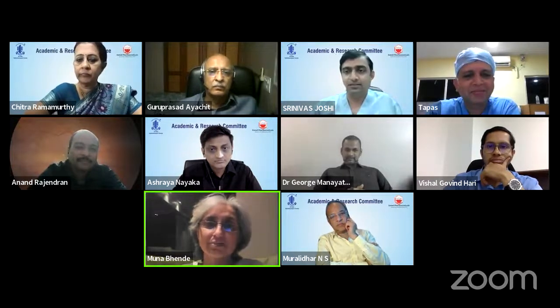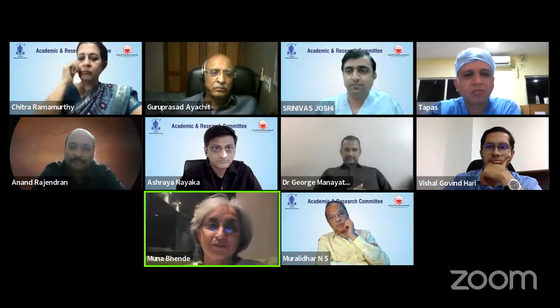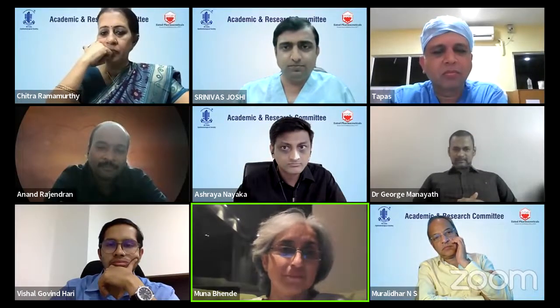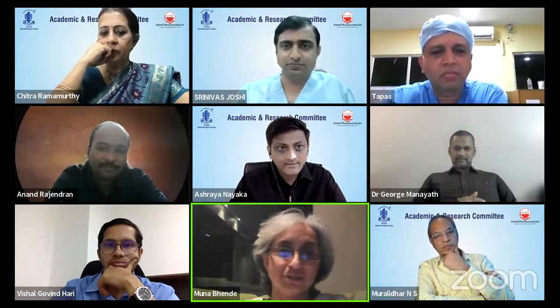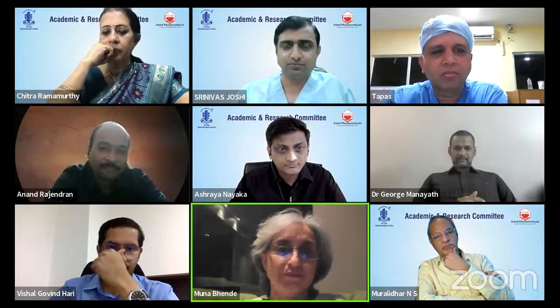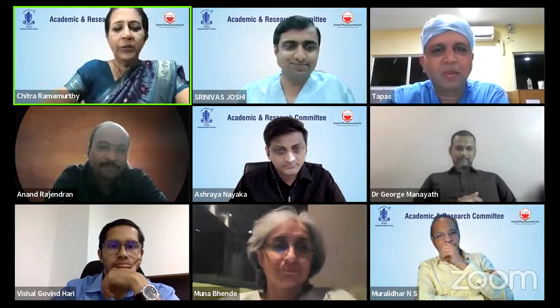Tapas, that was a very nice talk. Dr. Muralidhar, sometimes a simple red-free photograph, which is available on any basic camera system, can confirm IRMA and new vessels. I think that's a cheap and effective way rather than getting a fluorescein angiogram or an OCT angiogram. I think we shouldn't ignore that use for it, even though we have advanced techniques. A simple thing like new vessels. Thank you very much for that.